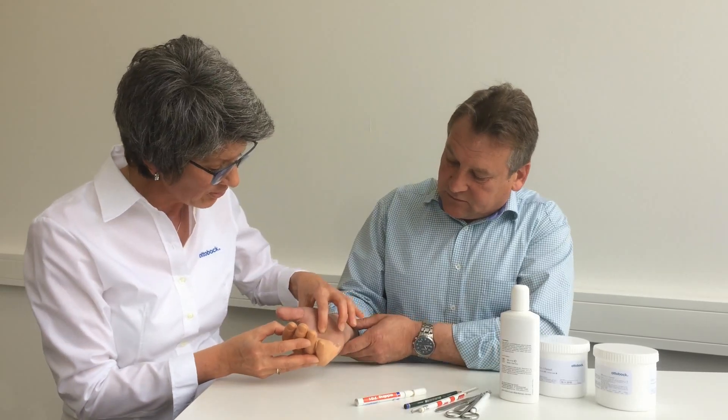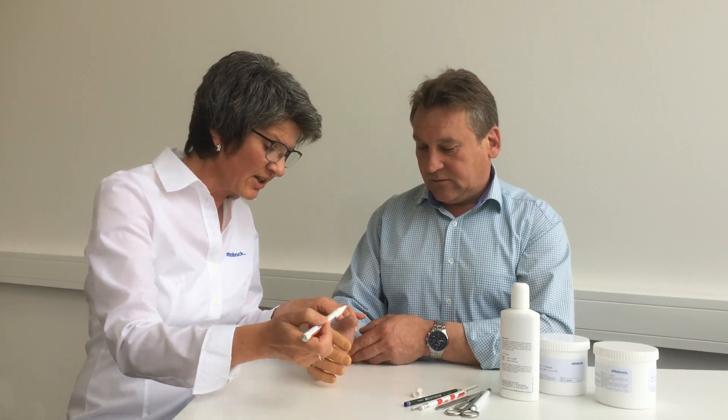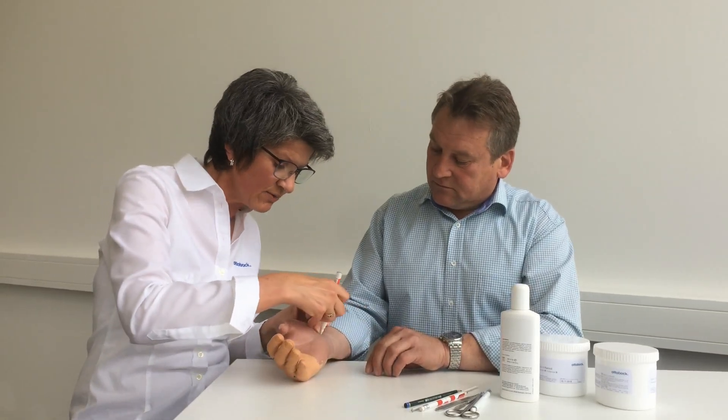I can see that there's still some air inside the hand, and I'd like to change that as well. I make sure to mark the brims before shortening the prosthesis so I don't cut the socket too short, which would prevent the prosthesis from staying on.